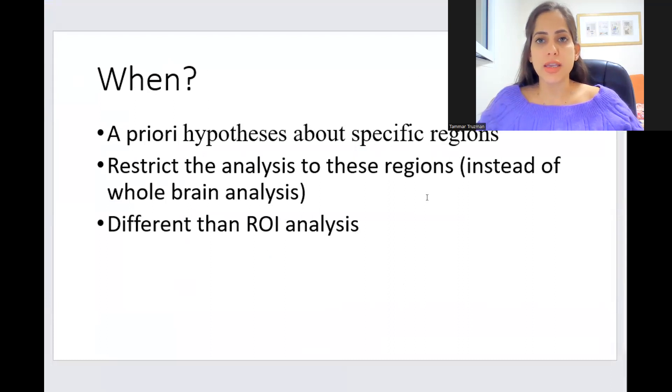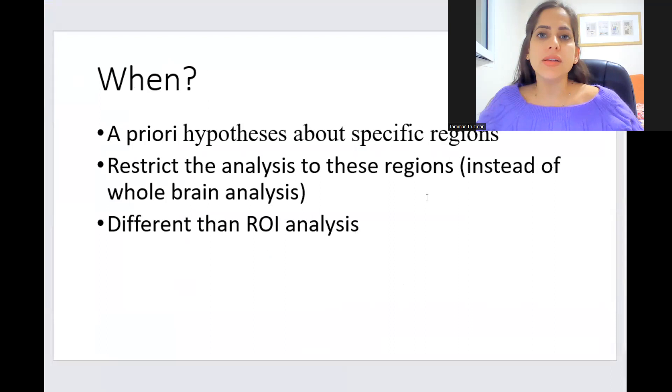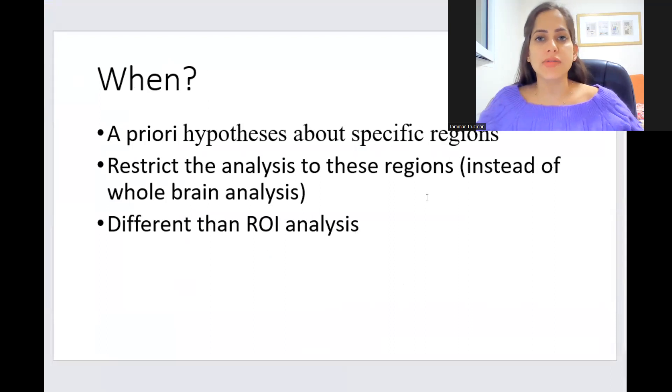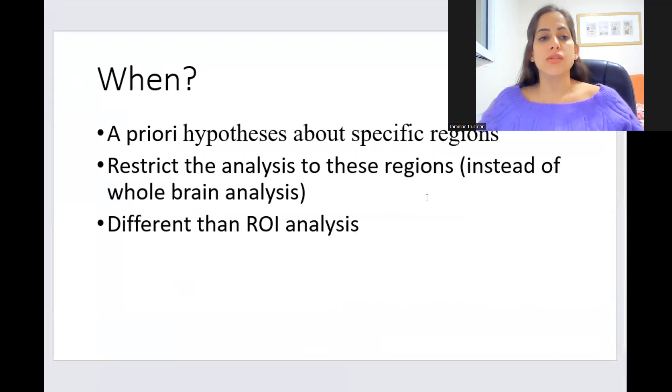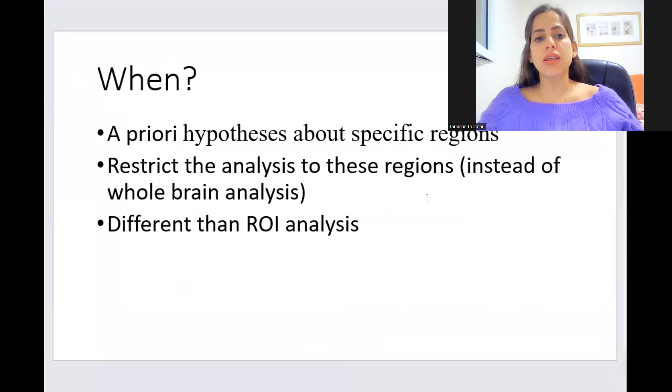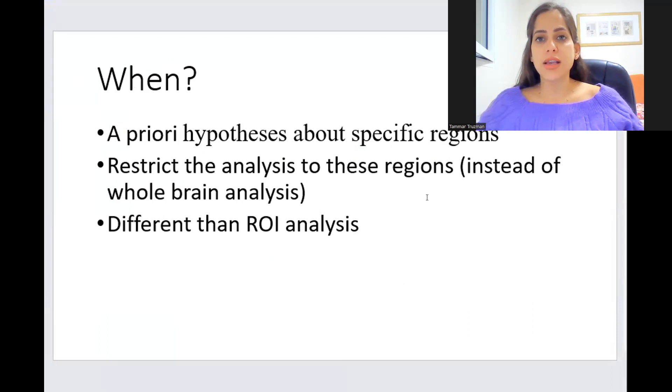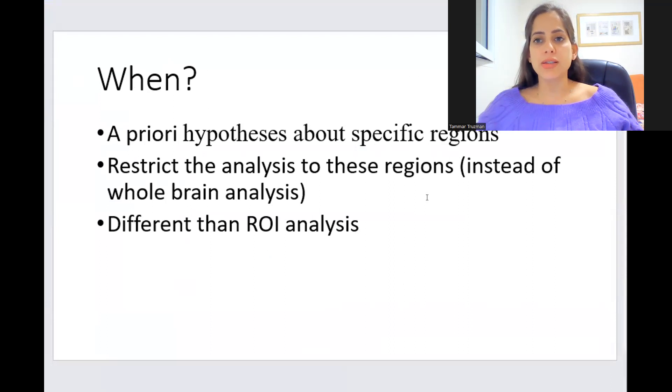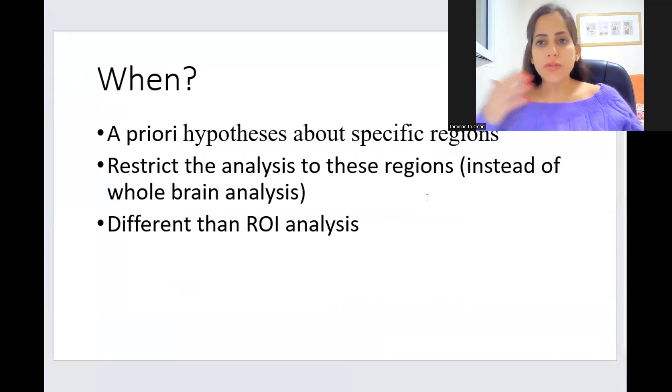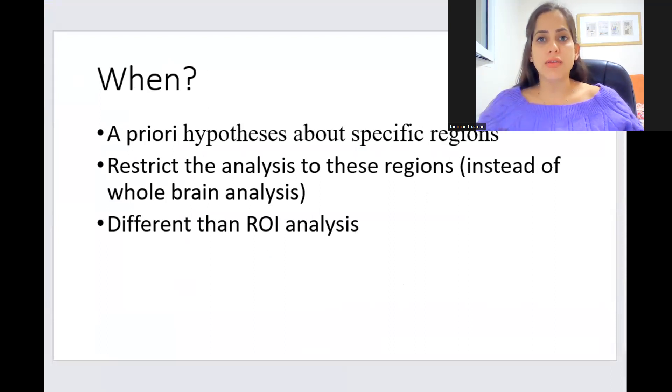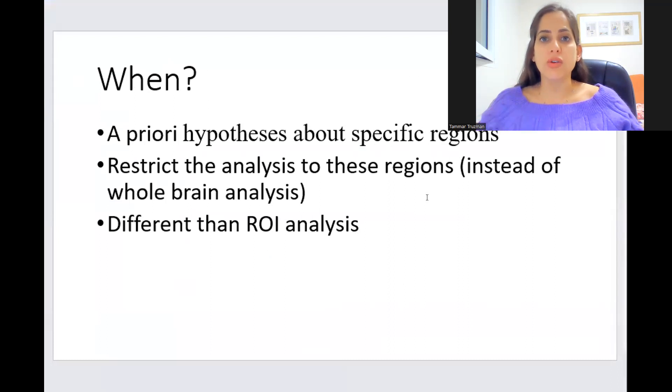So let's say you have a hypothesis about the amygdala and how it is activated during specific tasks. So what you do is you restrict the analysis to these regions, and instead of doing multiple comparisons correction for all the voxels in the brain, you're only correcting for the voxels within your VOI.